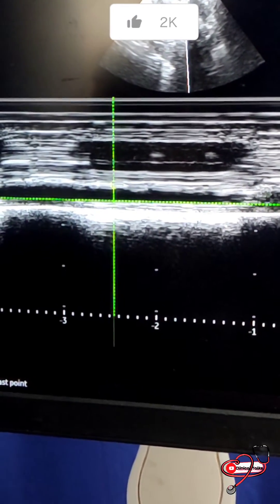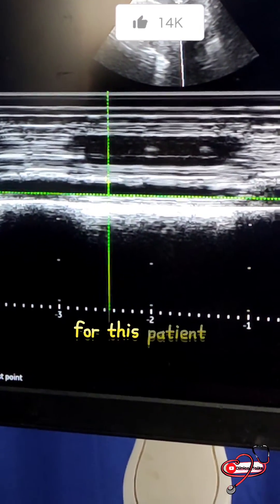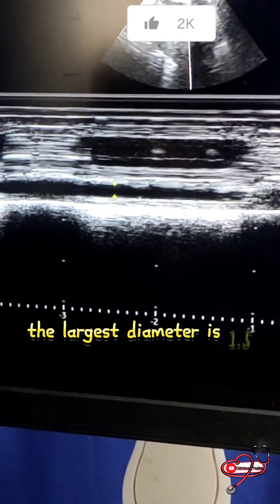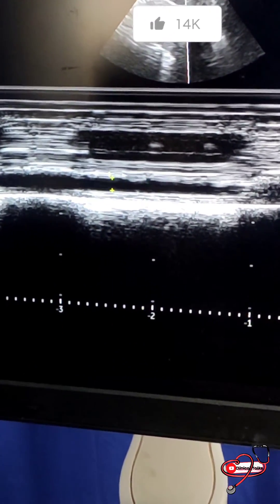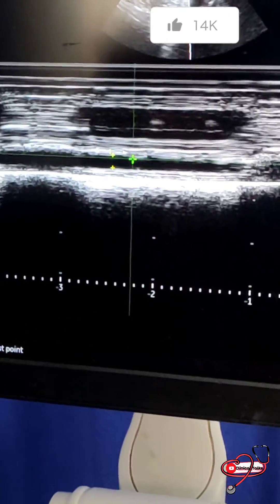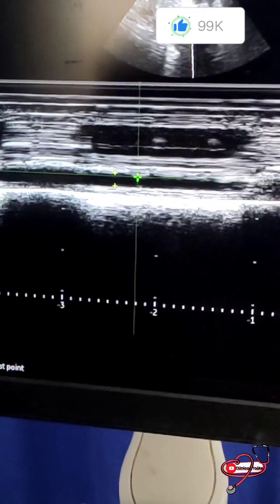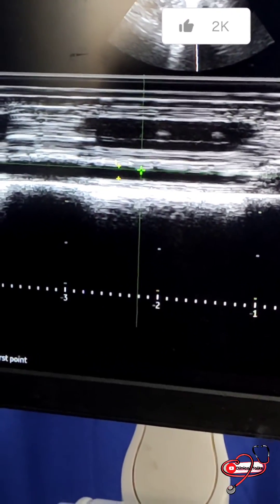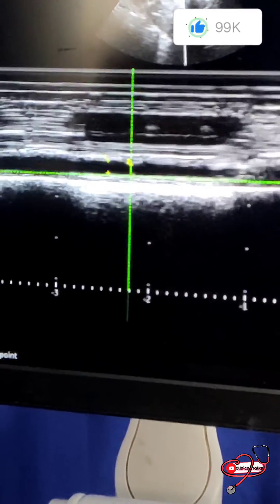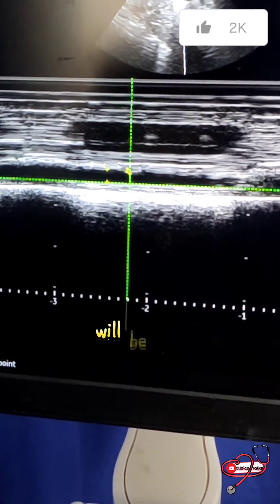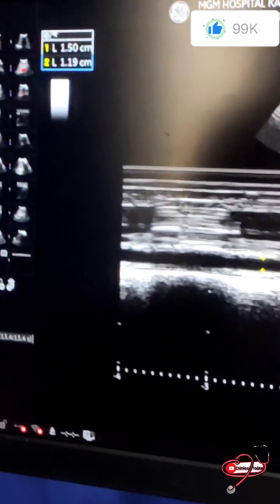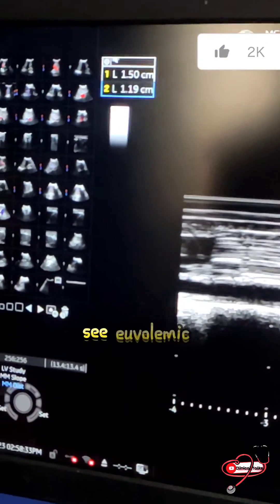For this patient, the largest diameter is 1.5 cm and the smallest diameter is 1.19 cm — this is euvolemic.